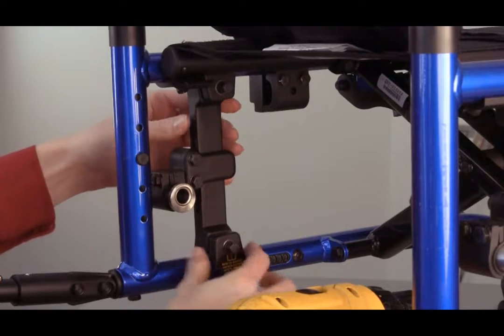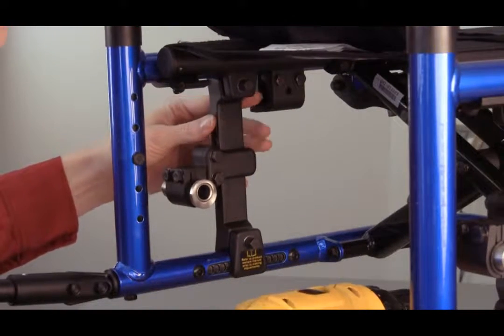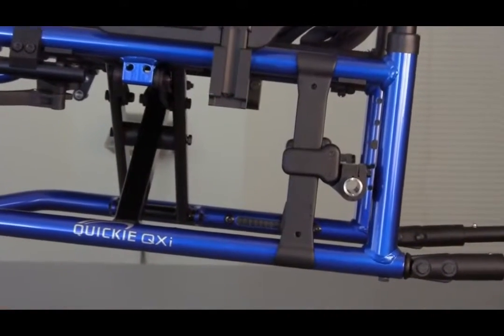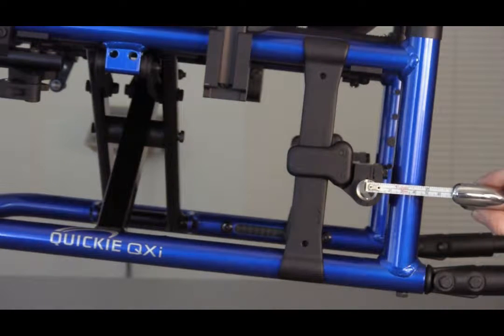The Quickie QXI is equipped with an adjustable axle plate for center of gravity and seat-to-floor height adjustments. The chair ships from the factory with the specified rear seat-to-floor height and the one-inch center of gravity position. In essence, this means that the axle receiver is located one inch in front of the back post.